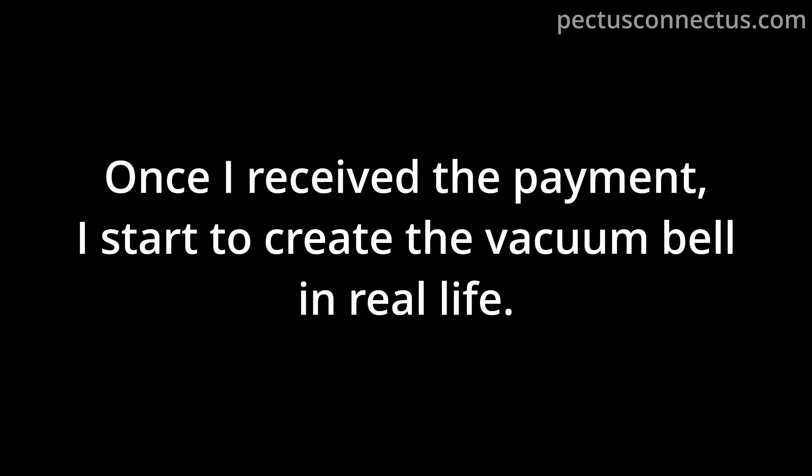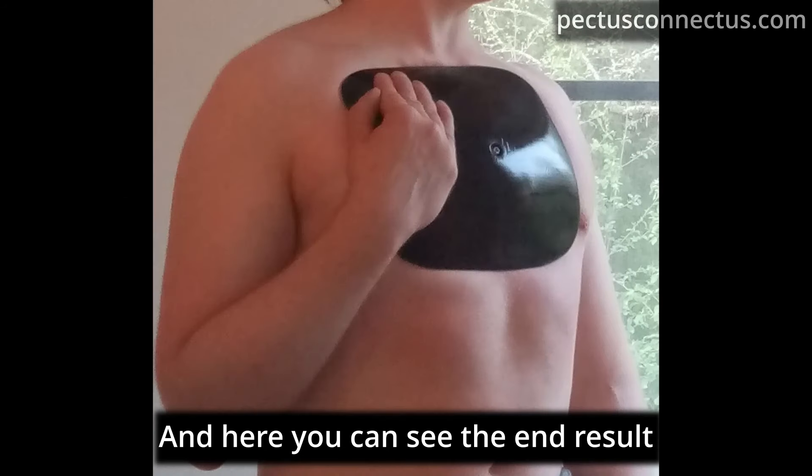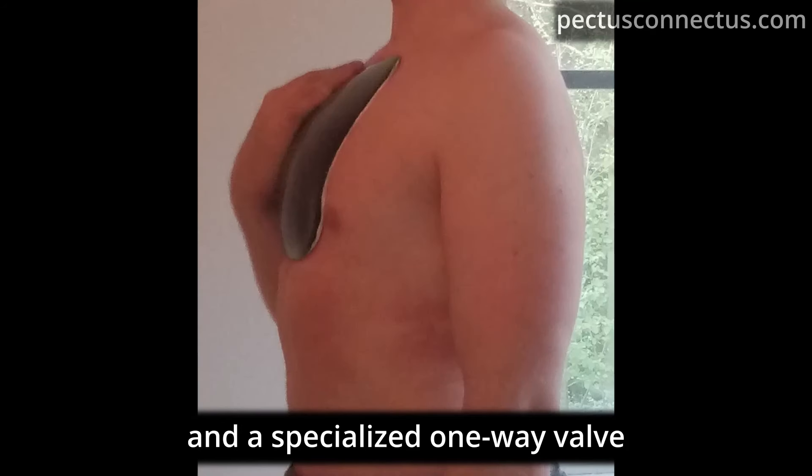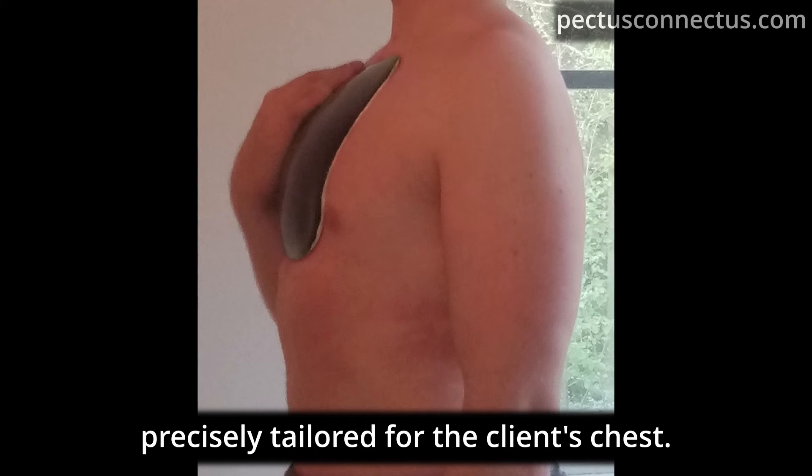Once I receive the payment, I start to create the vacuum bell in real life. And here you can see the end result: a 3D printed rigid vacuum bell with silicone flaps and a specialized one-way valve, precisely tailored for the client's chest.